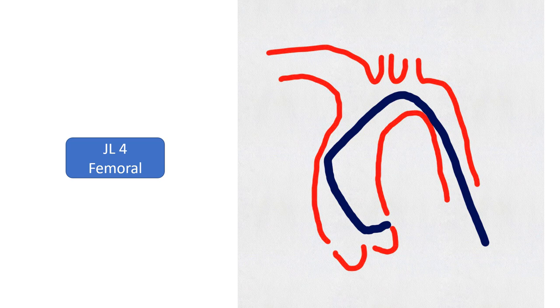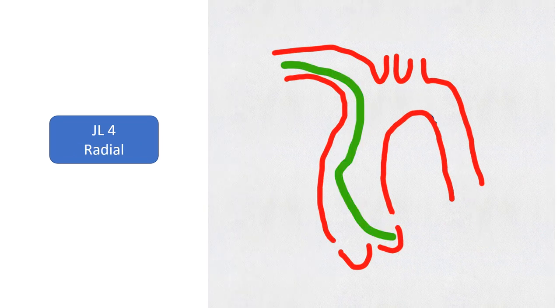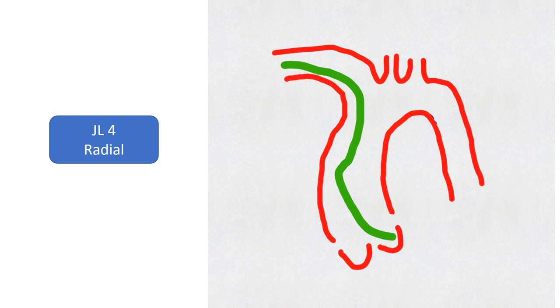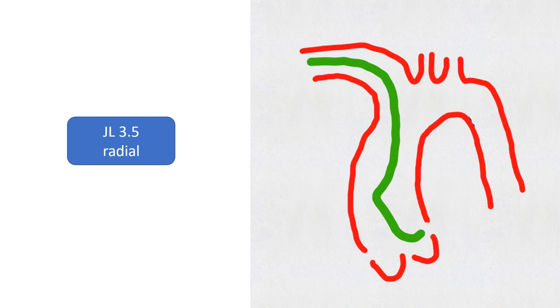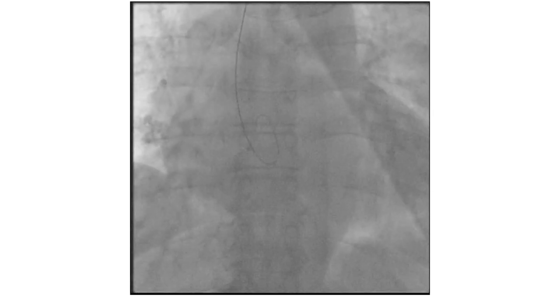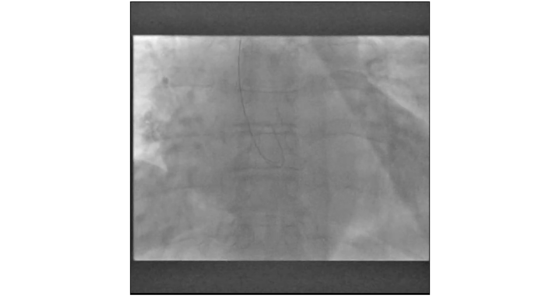The diagram shows a normal fit of JL4 to the left coronary artery. When the same catheter is used in radial approach, it appears to be large and the tip points downward. Engagement and angiography will not be optimal. That's why downsizing to JL3.5 is needed for right radial approach, and this is usually optimal as shown in this fluorosave.